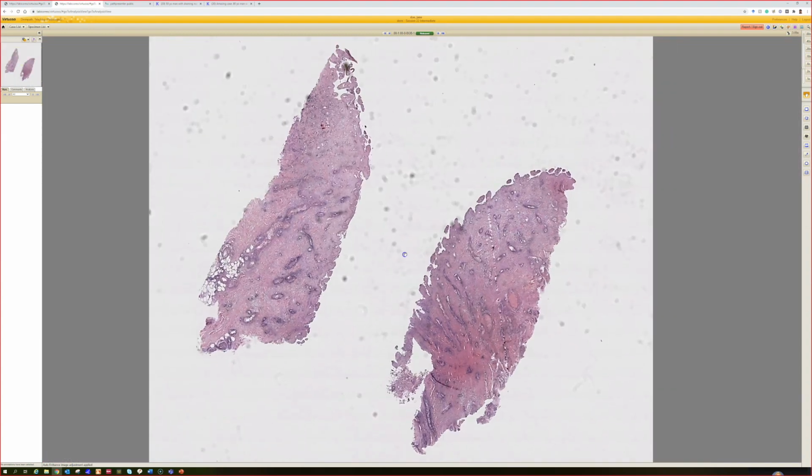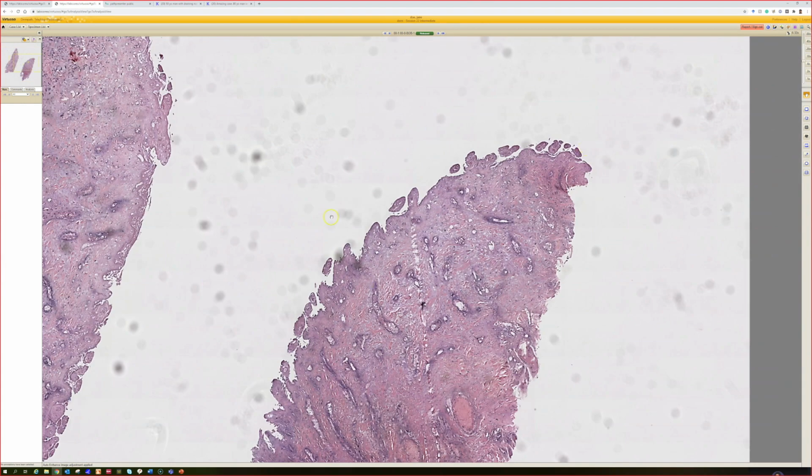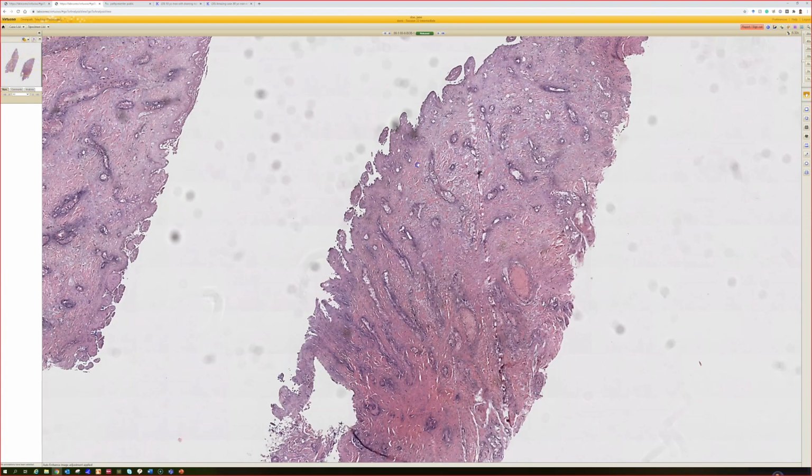Now this is a great one. Something I've never actually seen in practice, or at least not that I've recognized. Who wants this? Number 8. Oh, interesting. Oh, now you're like, oh, the thing I thought it was can't be. I don't know about that. It looks like very sick tissue. Like I think the epidermis came off. Yeah, totally detached. You can see the festooning, right? The little papillary dermis is there, but the epidermis is gone.